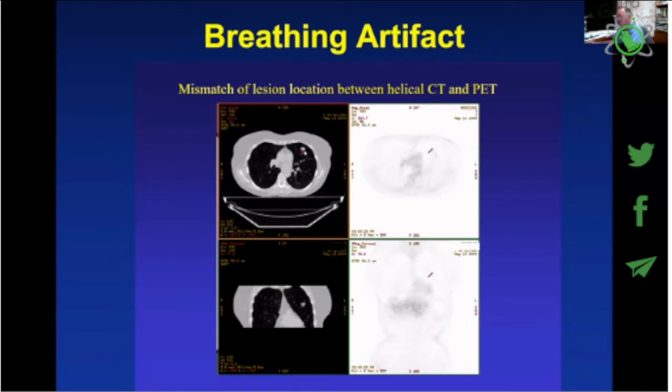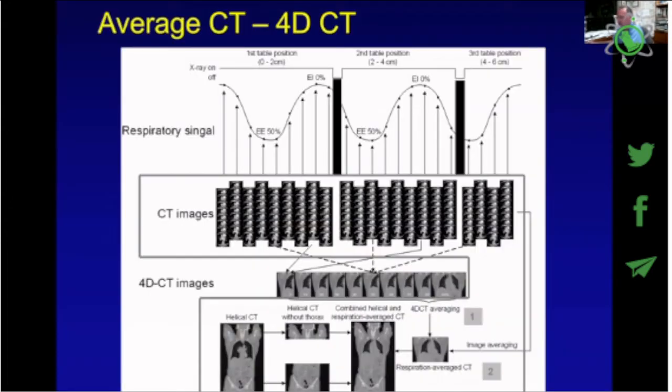You can see here much clearer, if you have a tumor on the CT image, you cannot see it on the PET image, and as such, that tumor will be underestimated as far as activity concentration is concerned.